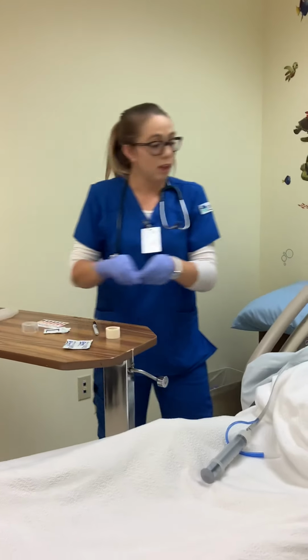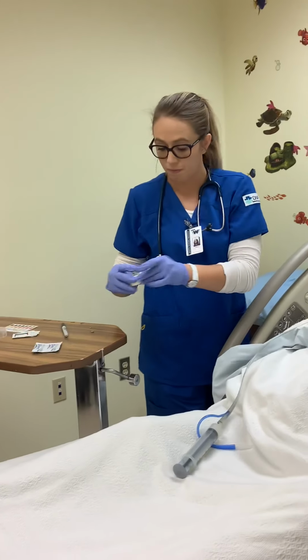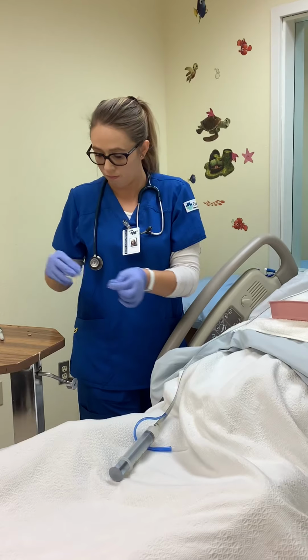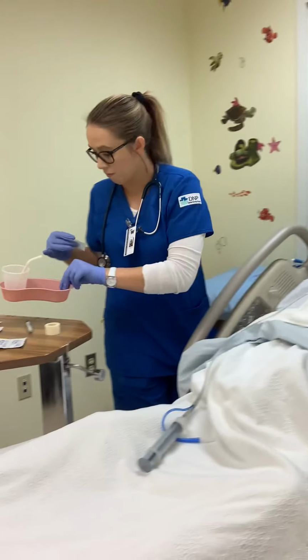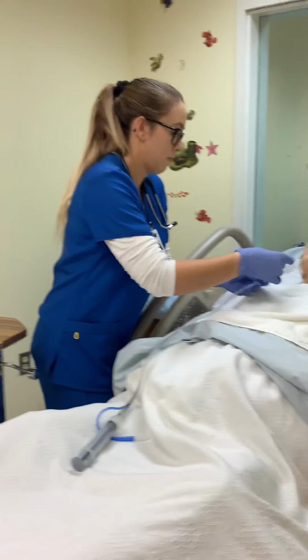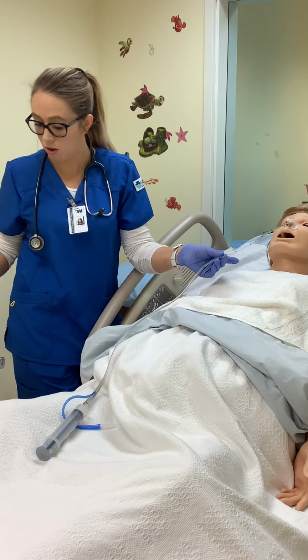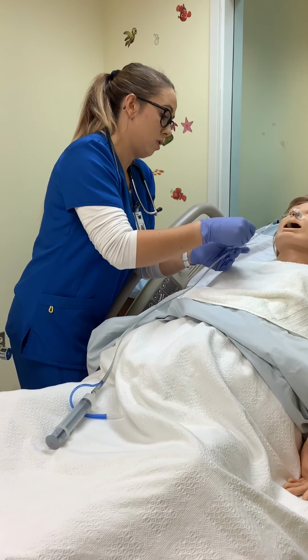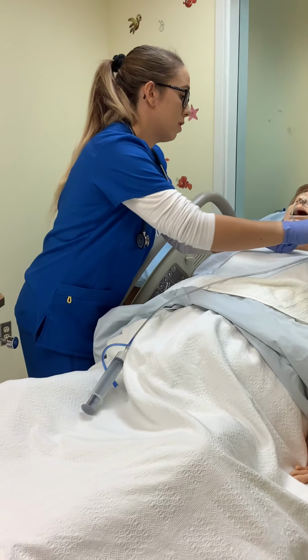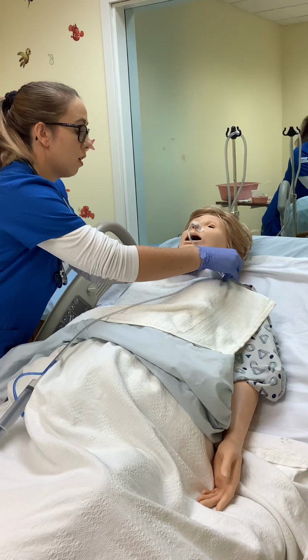Now I'm just going to pin it to your clothes. You want to use tape around it, but you don't want to tape it too tight to where it can ruin the tubing. Then you would just tape it to her gown, or safety pin it to her gown.